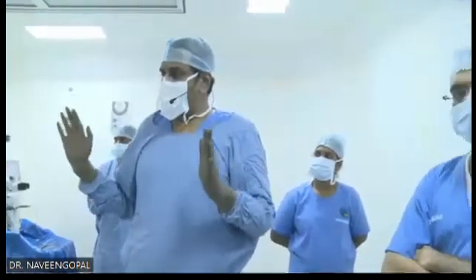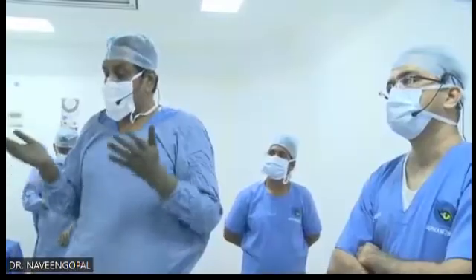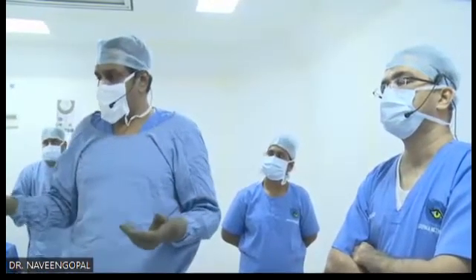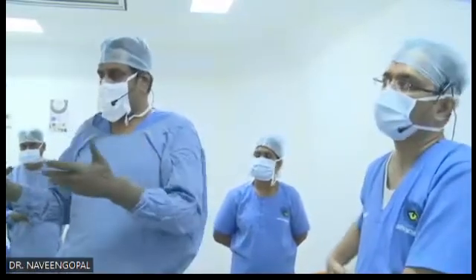I have started doing my ICLs with my basic setup. You can do it. It's very simple. Doing ICL itself, as you saw, is very, very simple. It took me hardly 1 minute to put the ICL and 2 minutes to position it. Putting the ICL is just a technician's job.